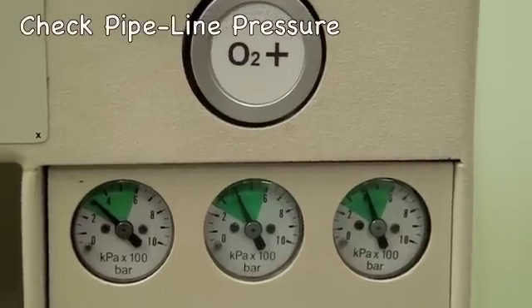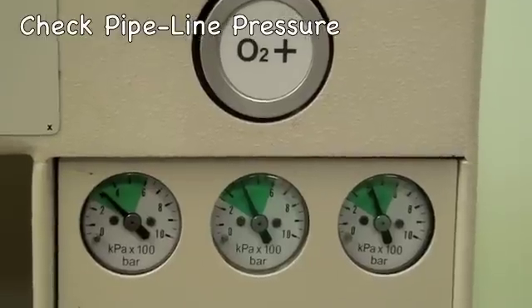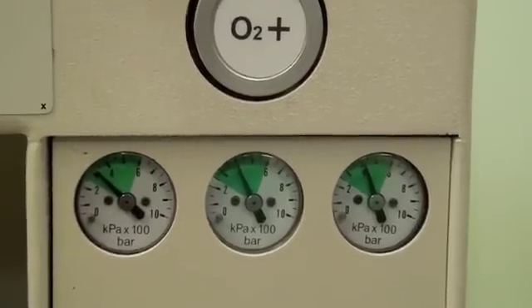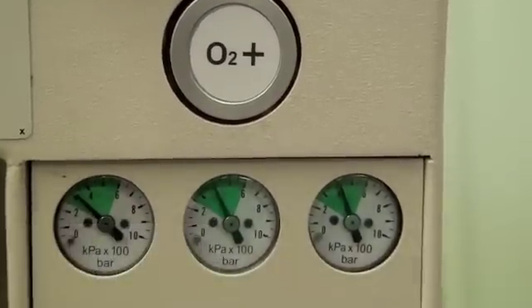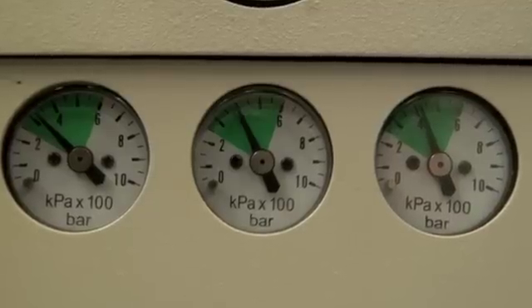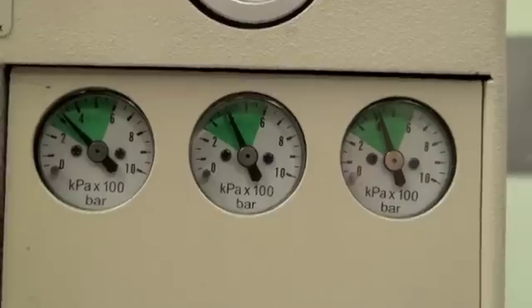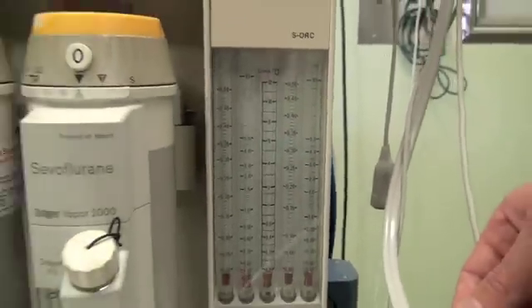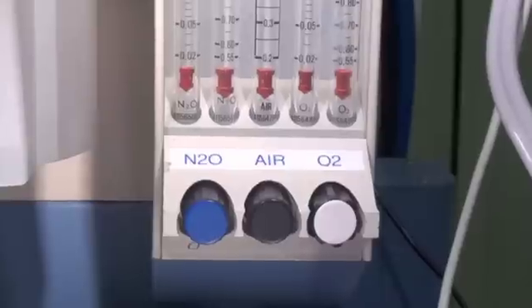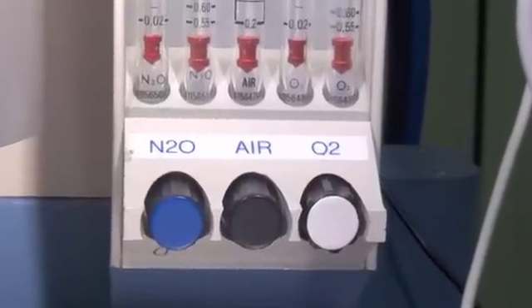One then checks the pipeline pressures of each gas on the front of the anaesthetic machine, and each one should be around 400 kPa. These gauges correspond to nitrous oxide, air, and oxygen.